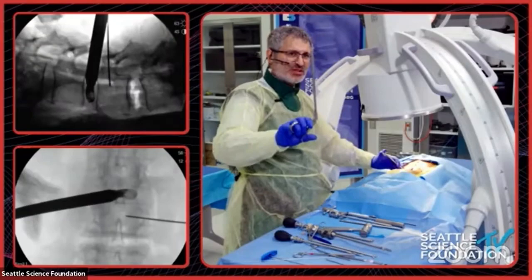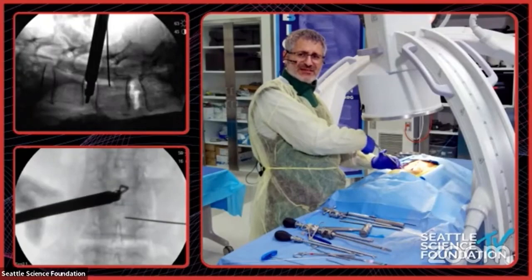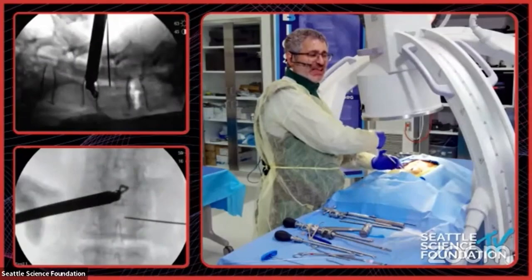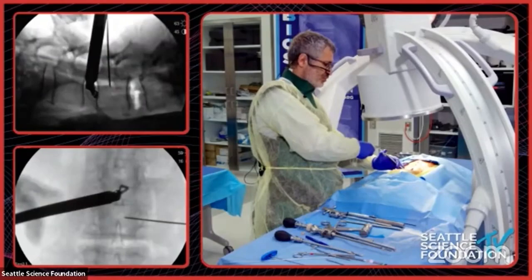This is one of my favorite tools — it's a so-called articulating curette that goes in both directions. I'm on the bone, I feel I'm on the bone. I can go to the lower end plate. I feel the high-frequency vibration — I am on the bone right now. In a real patient, I don't use the fluoroscope for this; I feel the high-frequency vibration of the rasp rasping the surface.